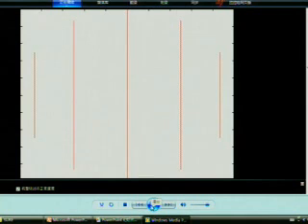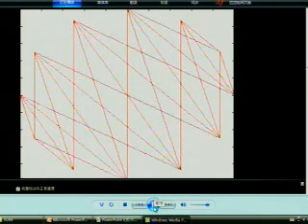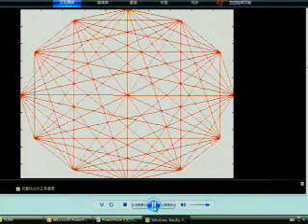We want the time of those paths that make a 0-degree angle with the y-axis to go to the first row of the matrix. And then the second row of the matrix contains the time of those paths that make a 15-degree angle with the y-axis. And the third row, the fourth row, and so on. As you can see, it contains all the data as the previous one. It just gets reallocated.